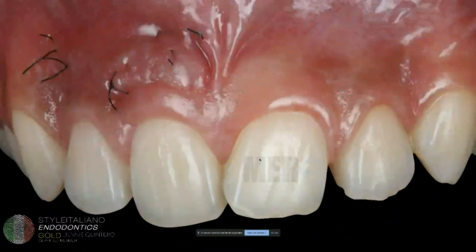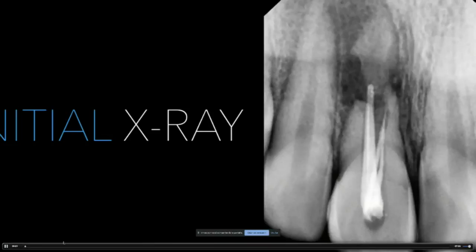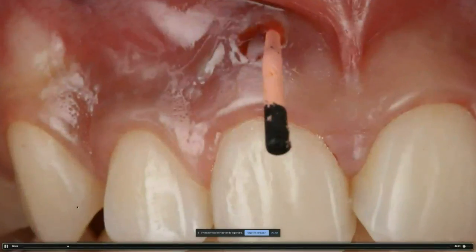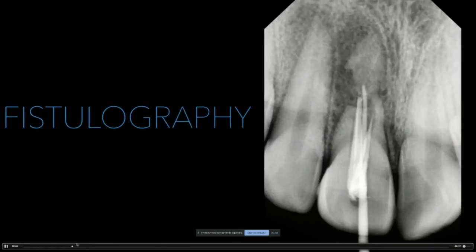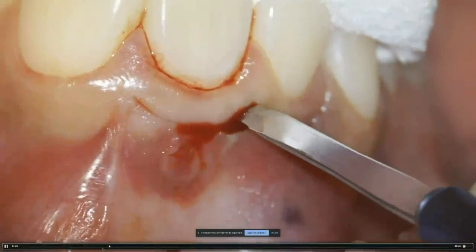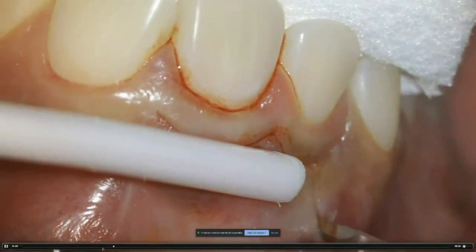1 week recall, okay? So right now, I'm going to explain this surgical part very quickly on a video. So as you can see here in the video, okay, I was making the diagnosis that I just showed you guys on the presentation. I'm just going to forward it a little bit more. And then with a microblade, a submarginal flap in this case.